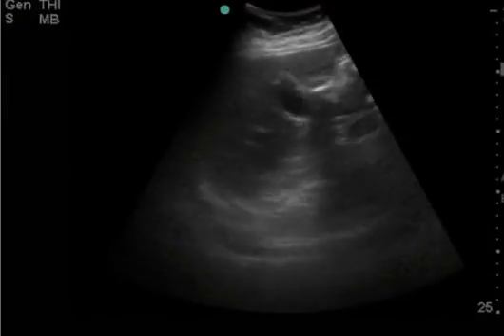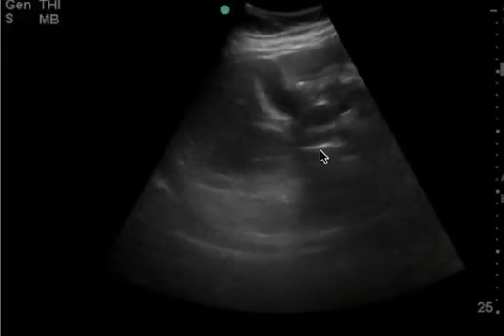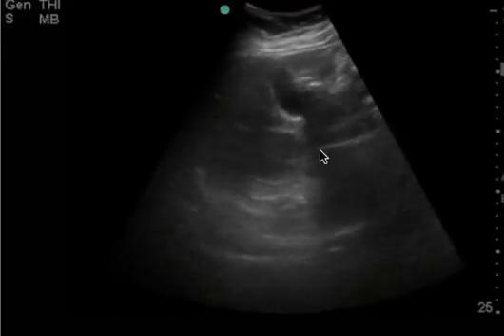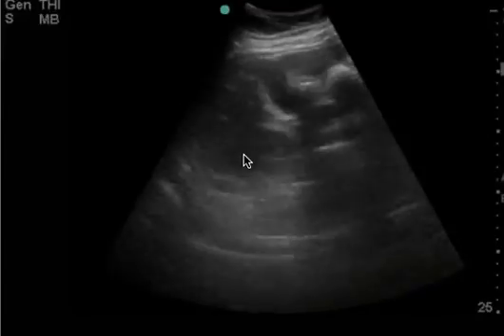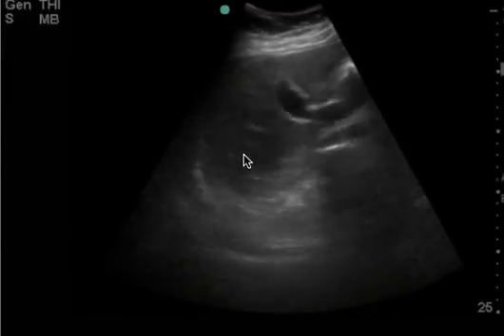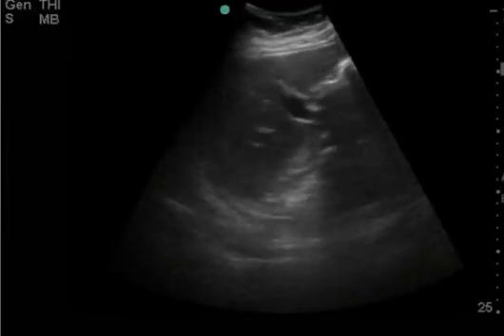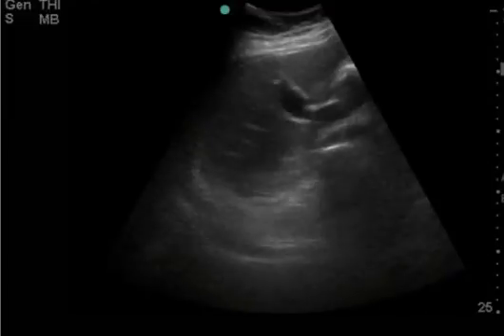Though with that said, I do think there are no stones. I would have preferred either zooming up a little bit or decreasing the depth to really make that decision more definitely, and I still think it's technically limited. But from what I'm seeing based on all the clips saved, I don't see any clear gallstones. But as I mentioned, it's a limited study because of the depth.